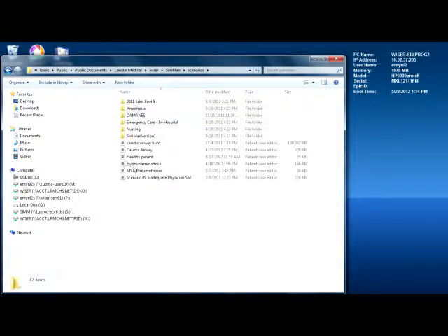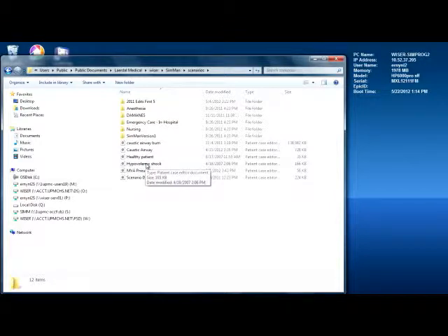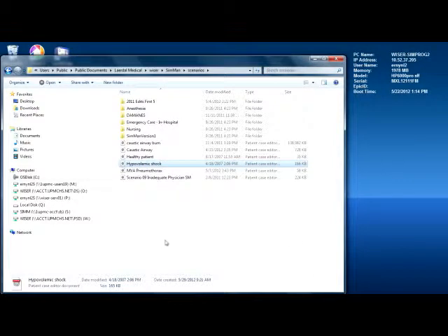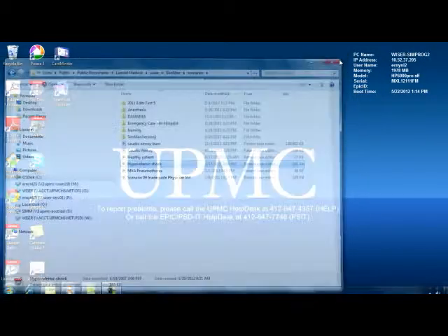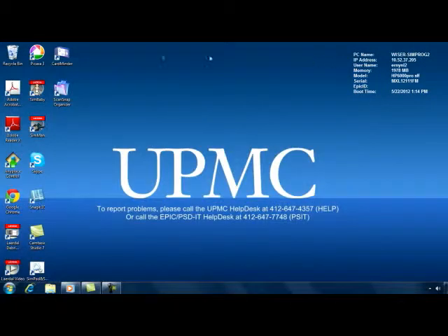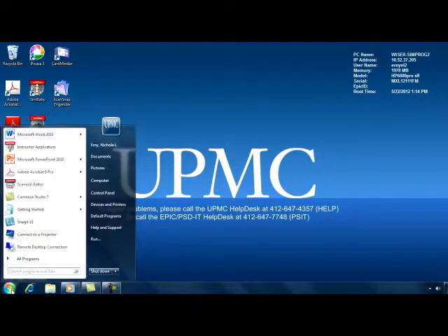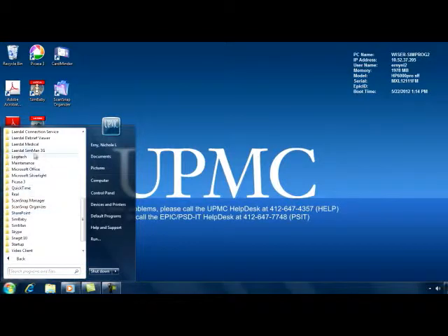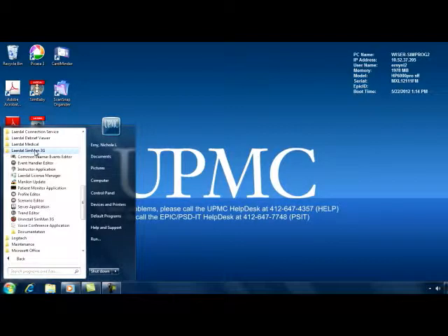Once you have copied the .sce file, you are ready to paste it into the scenario builder for SimEssential or SimMan 3G. In the start menu, select all programs, Leradol SimMan 3G or SimEssential, and scenario editor.